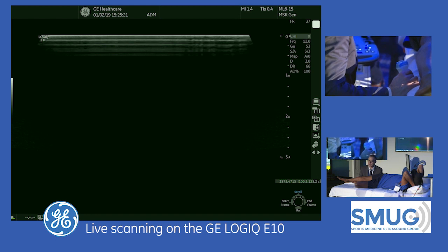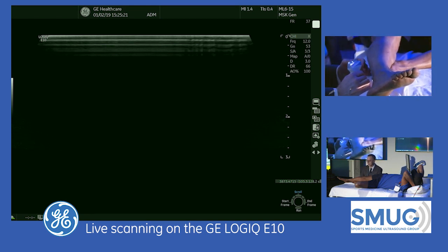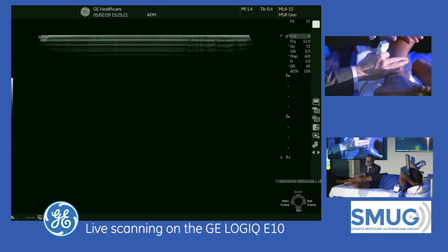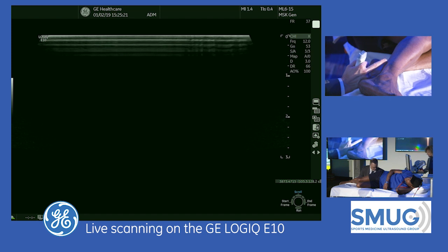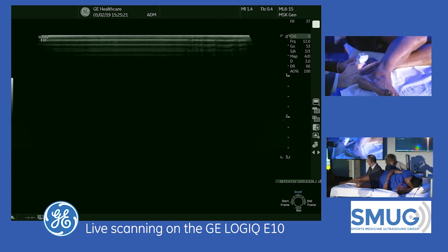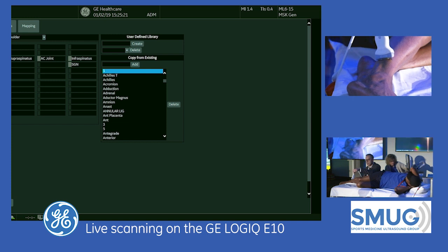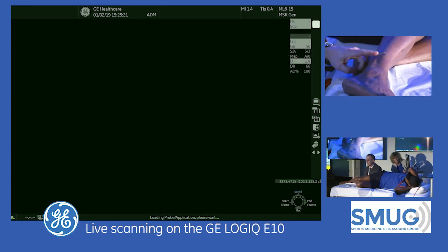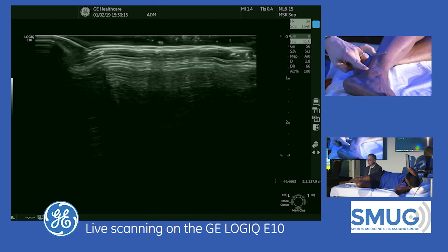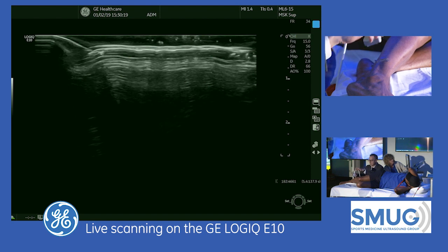I'll start with the superficial branch of the peroneal nerve, then the deep branch. The superficial branch is going to come out between the anterior and peroneal compartments about nine centimeters up from the fibular tip. So I know it's going to be in this area to start with.